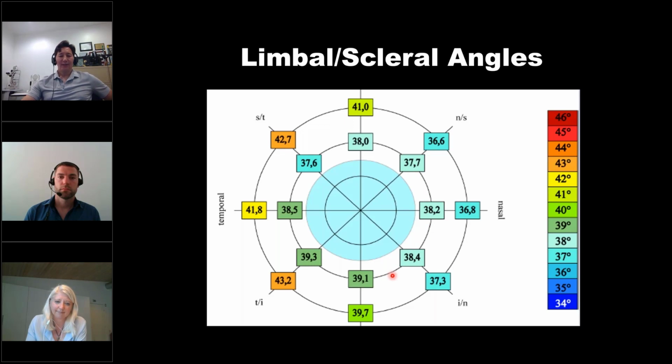So if we land a lens close to 15 millimeters, the eye doesn't have a lot of scleral asymmetry. If you move out to a 20 millimeter chord of bearing and take that angle down to 15 millimeters, then you have approximately a 6.6 degree differential all the way around the clock.